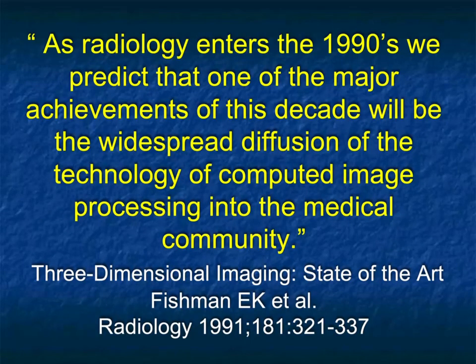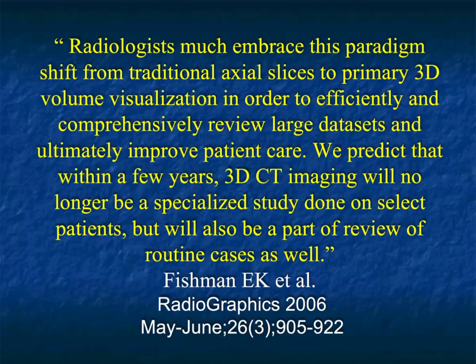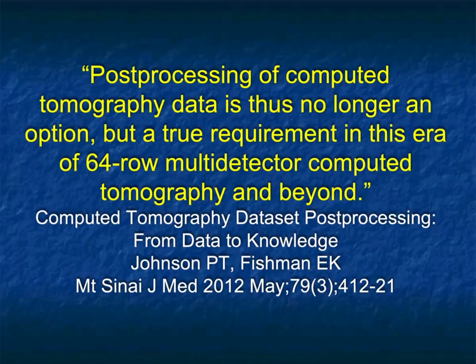Now, I have to admit, my understanding or my thoughts of what was going to happen in terms of 3D has been a little bit off. This was a state-of-the-art article published in Radiology more than 30 years ago. And I said that as radiology entered the 1990s, we predicted that 3D imaging would be everywhere, anywhere, all the time. I was wrong, and I published an article in 2006. And look at that statement. Within a few years, 3D imaging will no longer be a specialized study done on select patients, but will also be part of a review of routine cases as well. That's only 17 years ago, and I was still not exactly right.